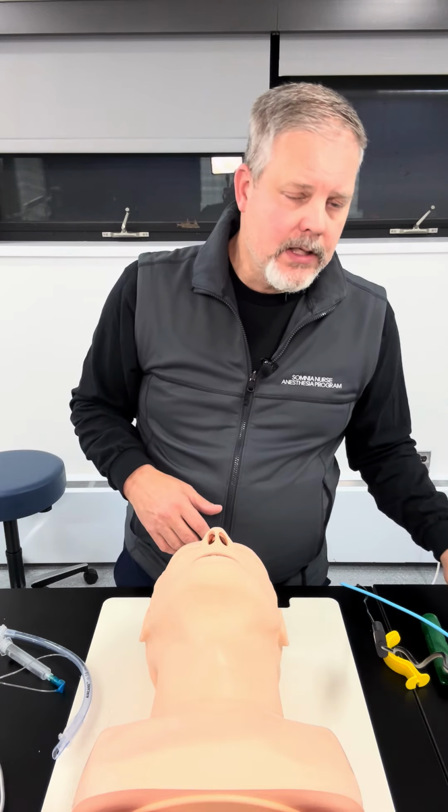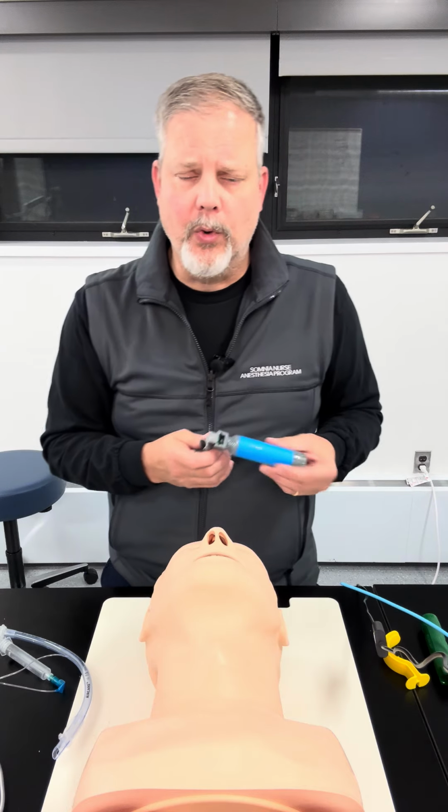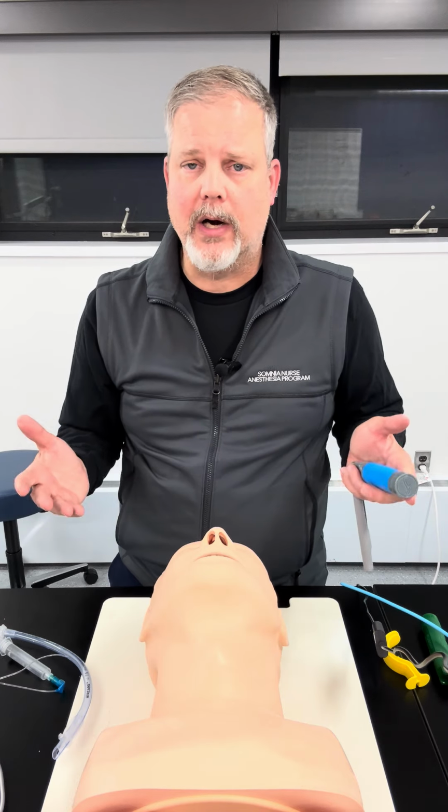So again, let's talk about how we're going to place this airway. For devices, obviously we're going to need our laryngoscope handle and blade. We're going to need the bougie, and then we're going to need an endotracheal tube. Now, if you're using a bougie, you'll use an endotracheal tube without a stylette. We'll show you why. So, first step, we're going to do a direct laryngoscopy on our patient.